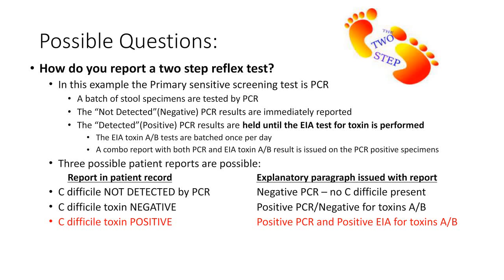How do you report a two-step reflex test? Well, this is just an example. It's not the end-all. It's kind of the way we decided to go, but I'm sure there are many other good options for reporting. In this example, the primary sensitive screening test is PCR.